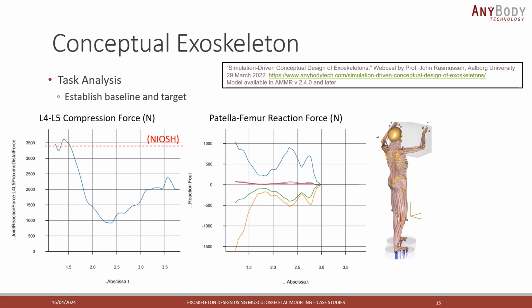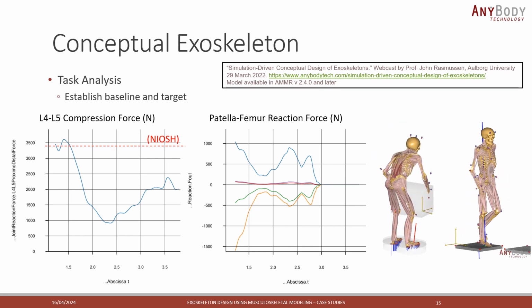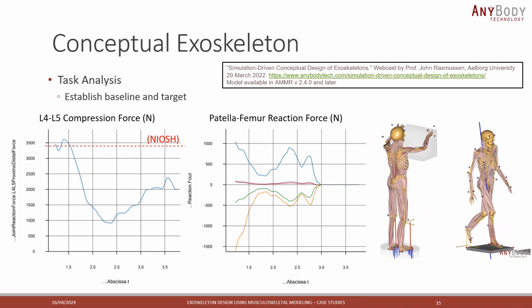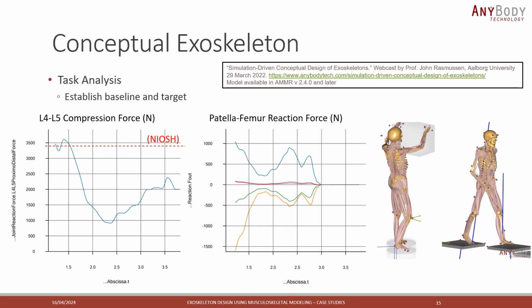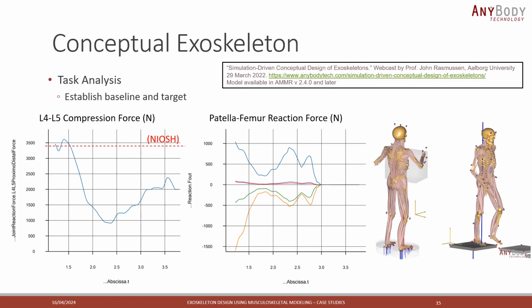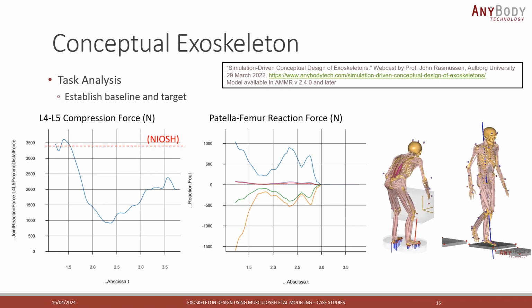And in this case, Professor Rasmussen suggested that when you do not have a recommendation from some source, then it could be interesting to compare to activities like walking, with the idea that we have evolved over thousands of years and we are very efficient at walking. This is something we can do several thousand steps every single day without causing any long-term damage to our body. So the logic is that the loads that we see in such an activity must be safe, and that can then be used as a target level or a reference for the patellofemoral reaction force.